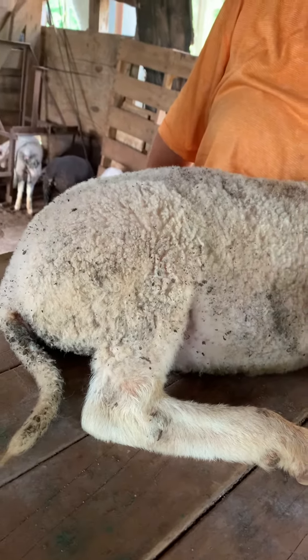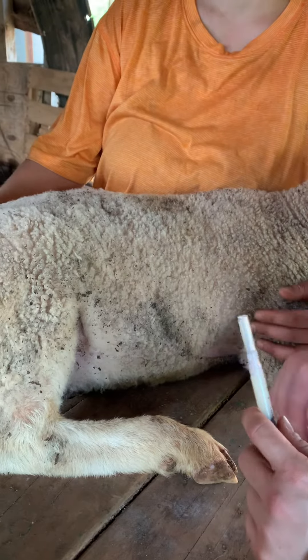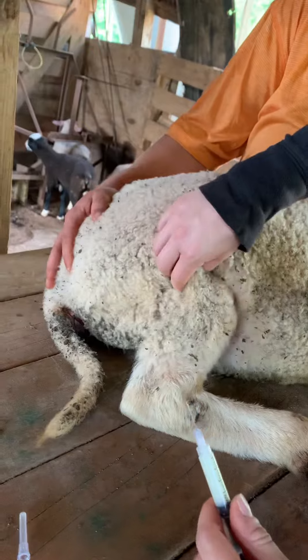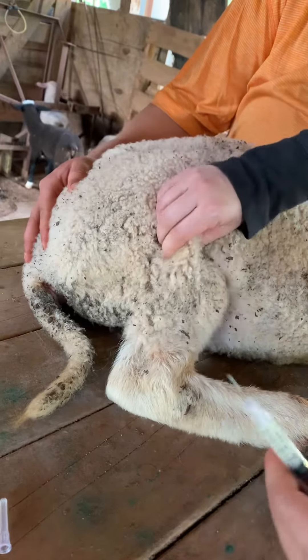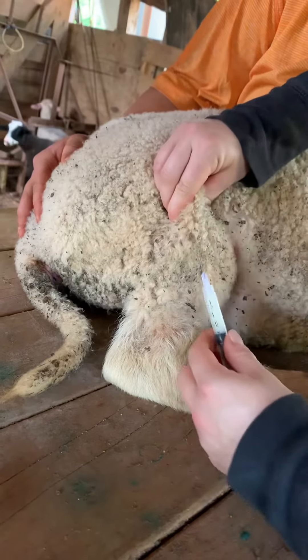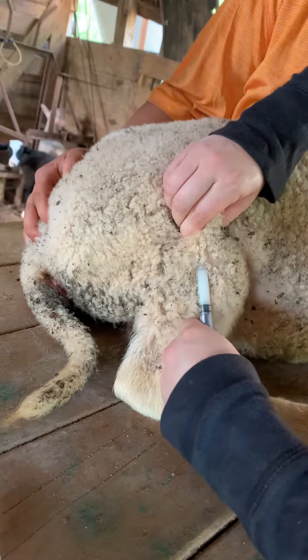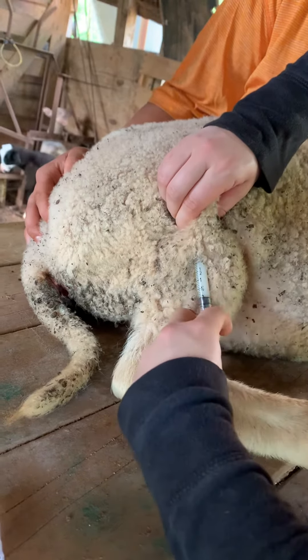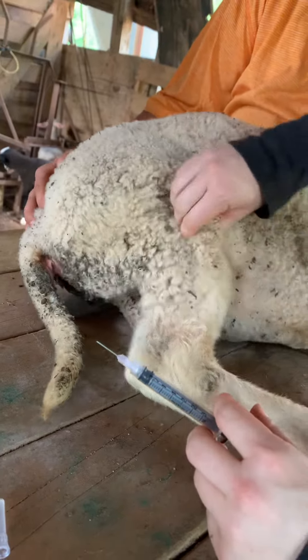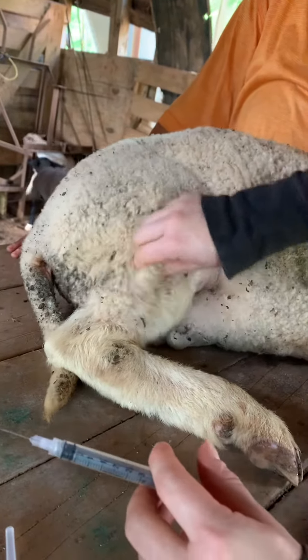Whoever's holding doesn't have to restrain him terribly, but just make sure he doesn't move during this. So T, tell us what you're doing as you go. Well, I took the lid off and I'm tenting the skin here. Then I go in. I feel for the needle. Then I aspirate, which is to pull back. And I push it in. Sometimes it's not all the way up so you just rub it. It doesn't really hurt him. If you don't jab him with the needle, he's less likely to flinch.